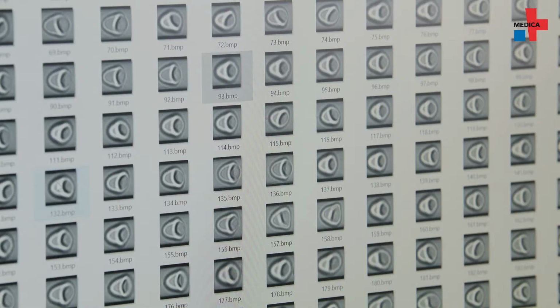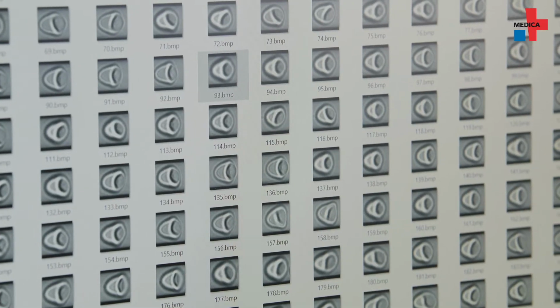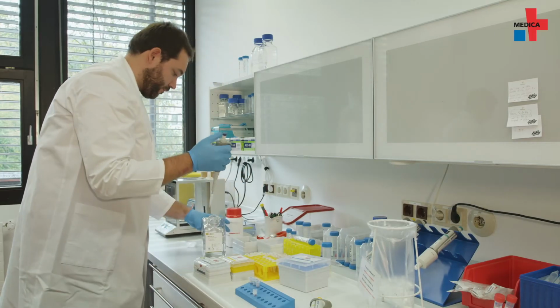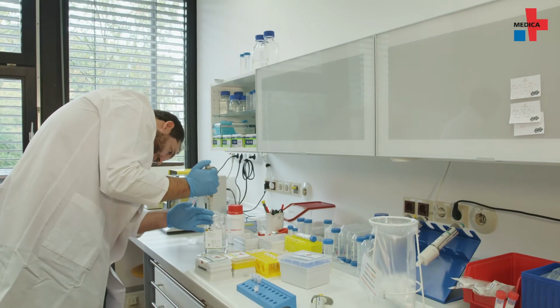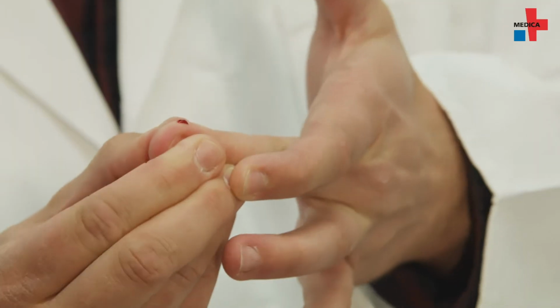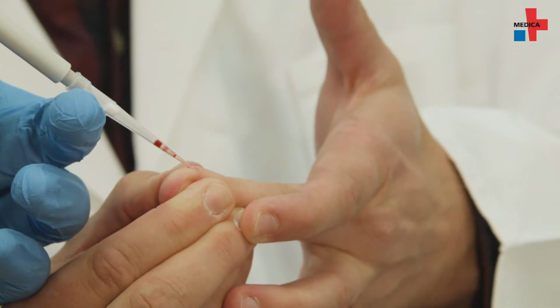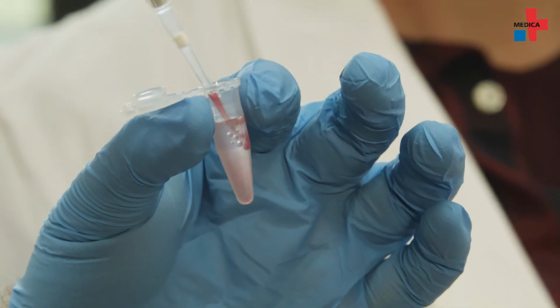The analysis software is able to automatically classify and characterize cells. The software studies and objectively assesses the images. That means we created a mathematical algorithm that objectively evaluates the cells. The blood cell classification software is based on artificial intelligence. Quint and Kihm required hundreds of blood cell images, which they manually classified, thus allowing the system to ultimately learn the different types of cells.